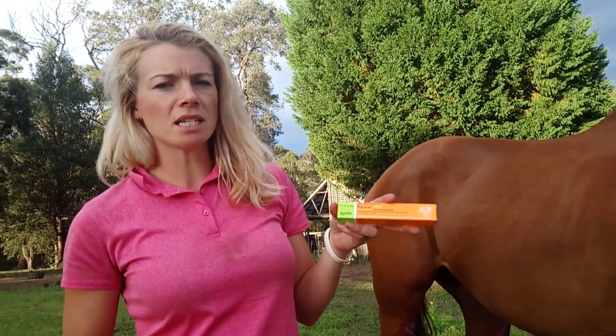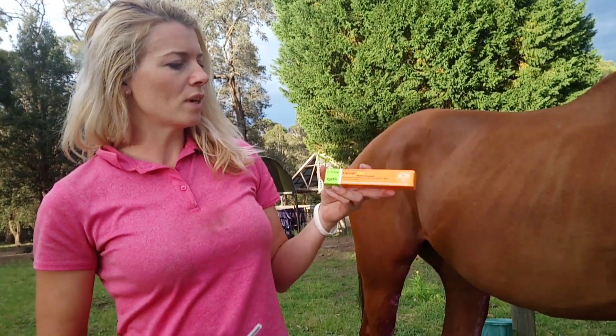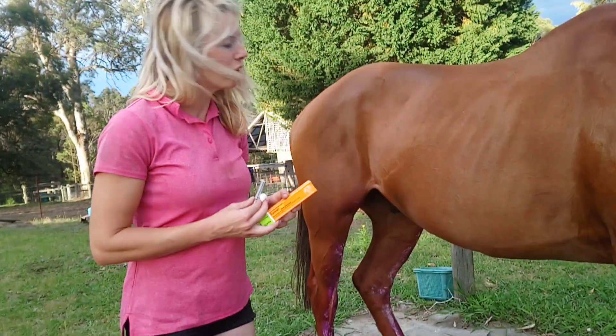What we're injecting is Equivac TAT. This is a tetanus antitoxin, and the reason that we're giving this to Fanta today is because he's had a bit of a fight with a fence.